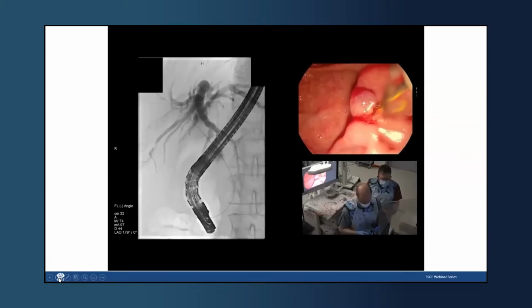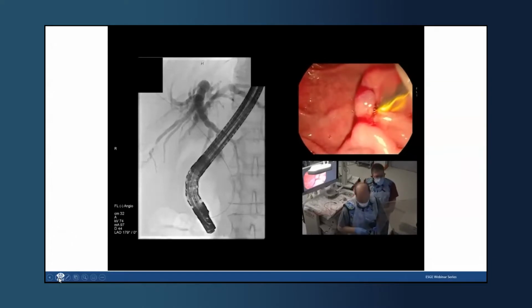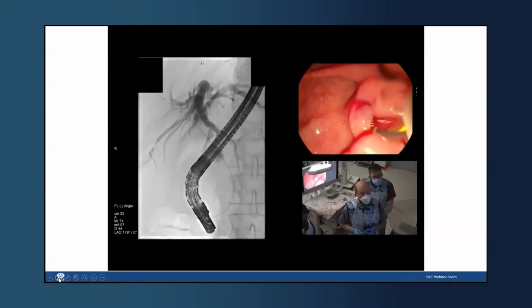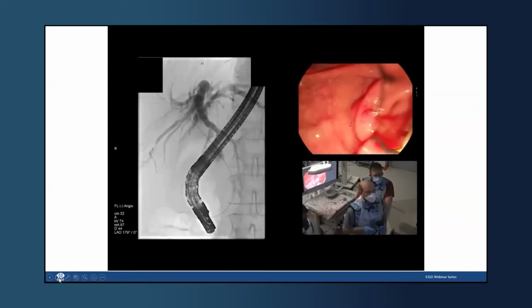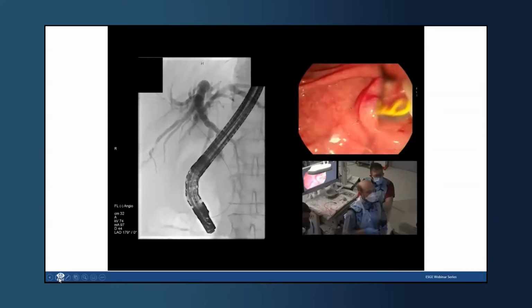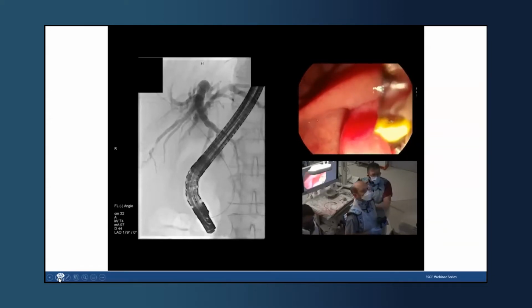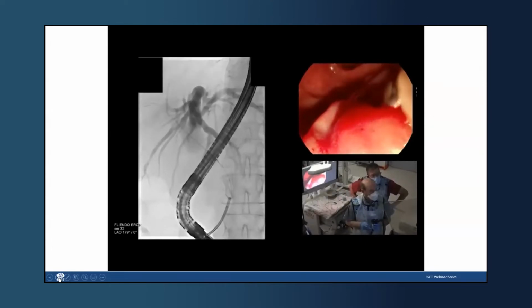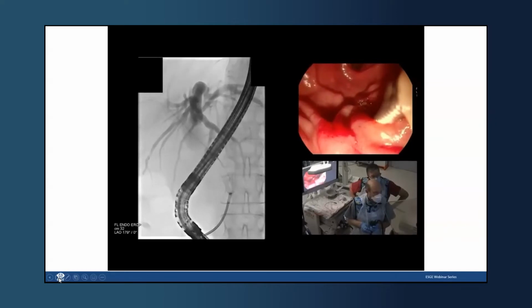We're just going to use an endobiliary biopsy here. Now it's a tight stricture, so we really don't want to discard or lose our wire. But I think we should be aiming, as a general rule, to use more than one modality to sample indeterminate strictures. That's good, and then just advance on that. Very nice.